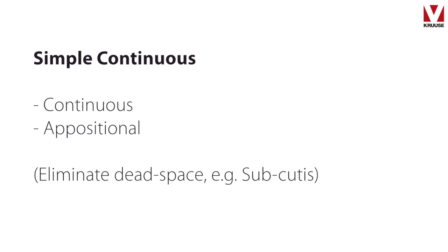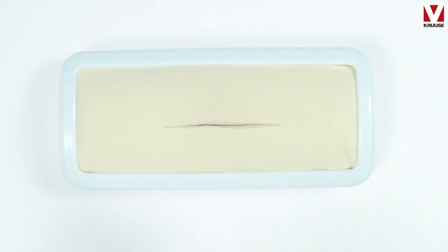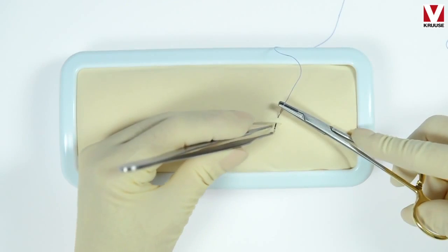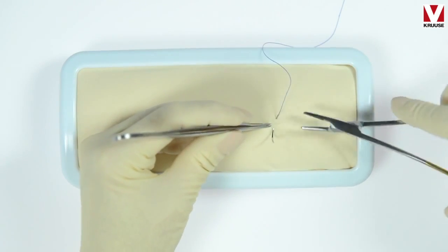A simple continuous suturing pattern. This is a continuous and appositional suturing technique. You can use it to eliminate dead space in subcutis or other areas.